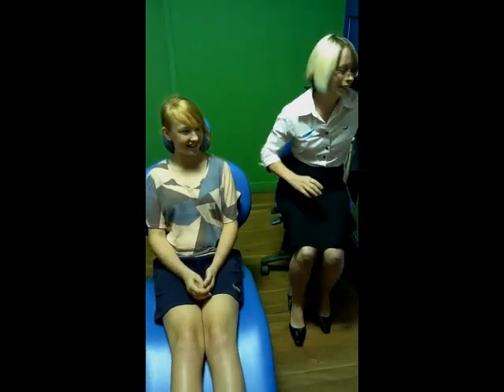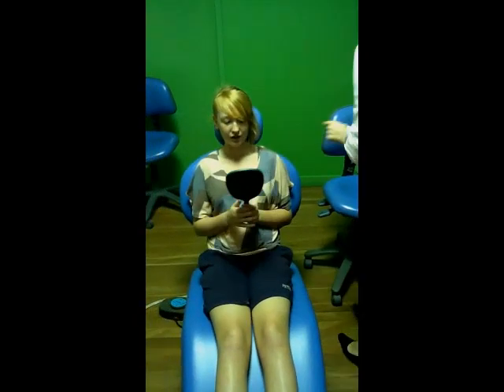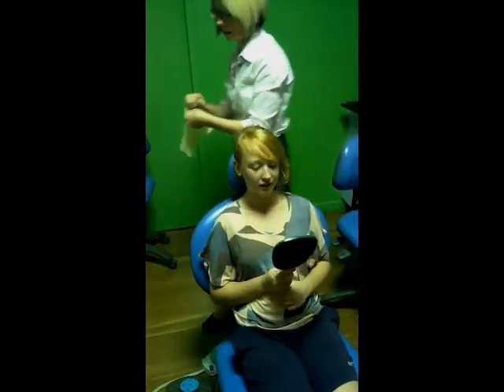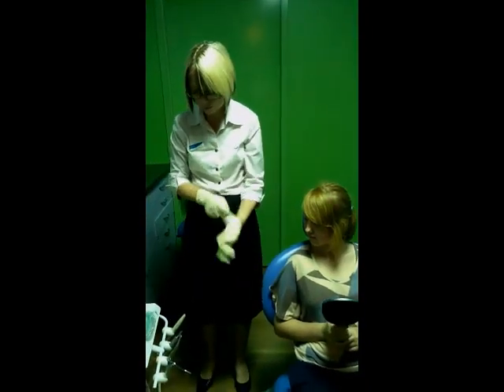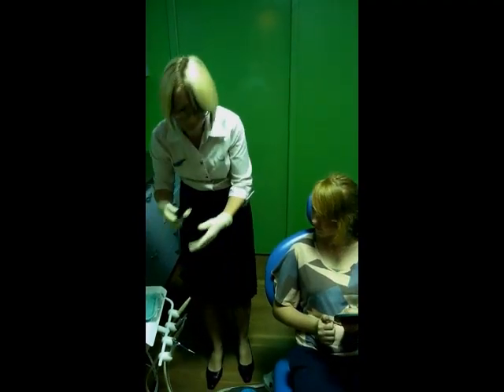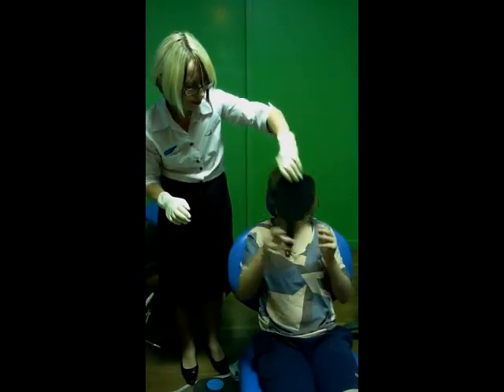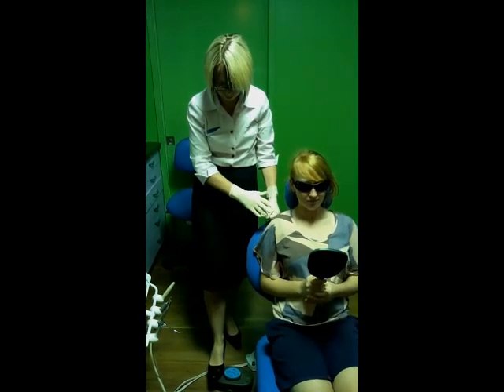On Tuesday. Tuesday, fantastic. Are you excited? Yes. Would you like to watch your spaces going in? Sure. So what I'm going to do is get you to wear sunglasses, because sometimes these little separators might fling around the room. So I'll get you to put these on for me. I'll put them around for you while you do that. And I'm just going to move your chair up and back a little bit, so don't get frightened when it moves.